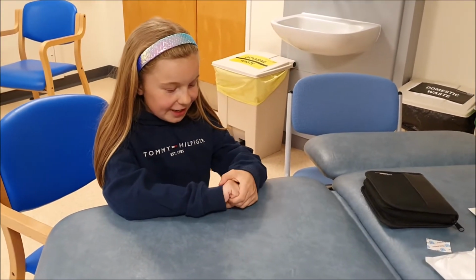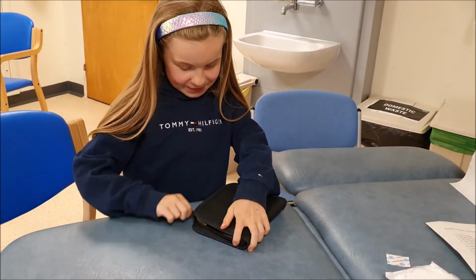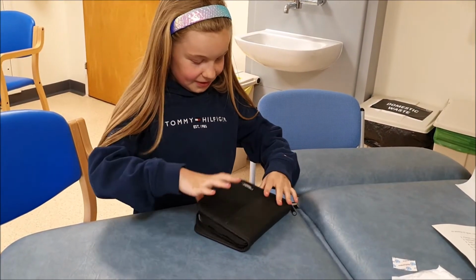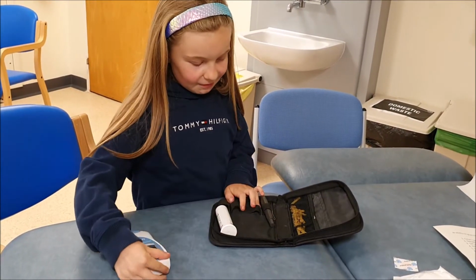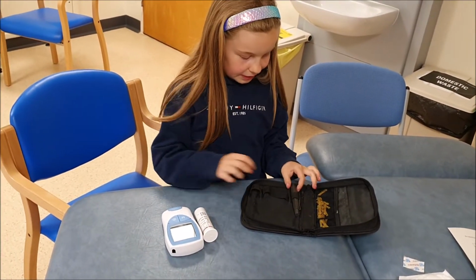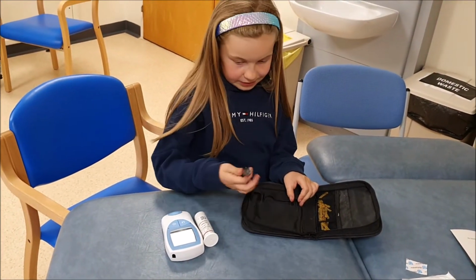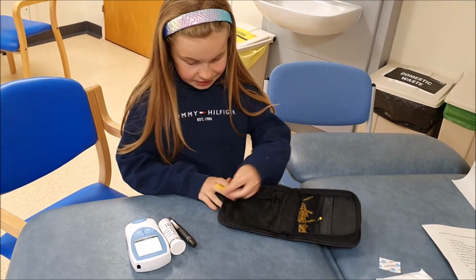So I'm going to show you how to set up your equipment. So first you need to get the bag. And then you want to get the monitor out. And then the strips out. And then you want to get your pen out. And then get a yellow needle.